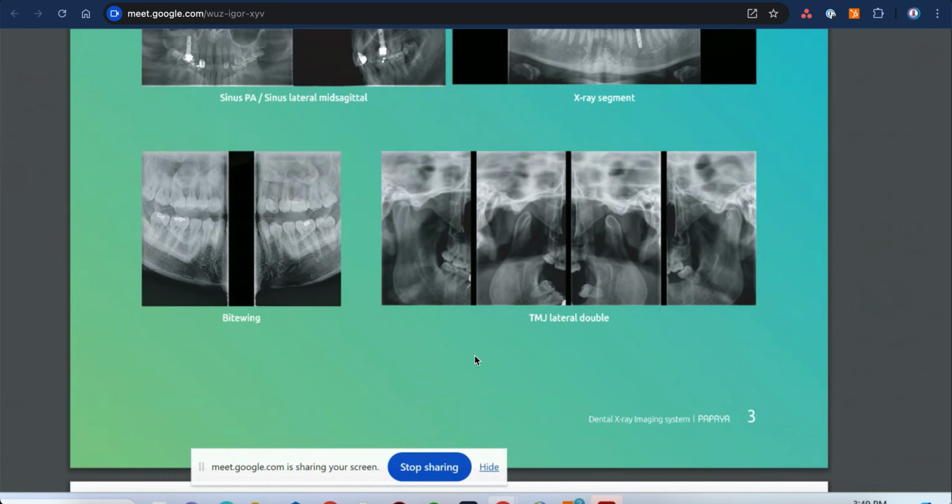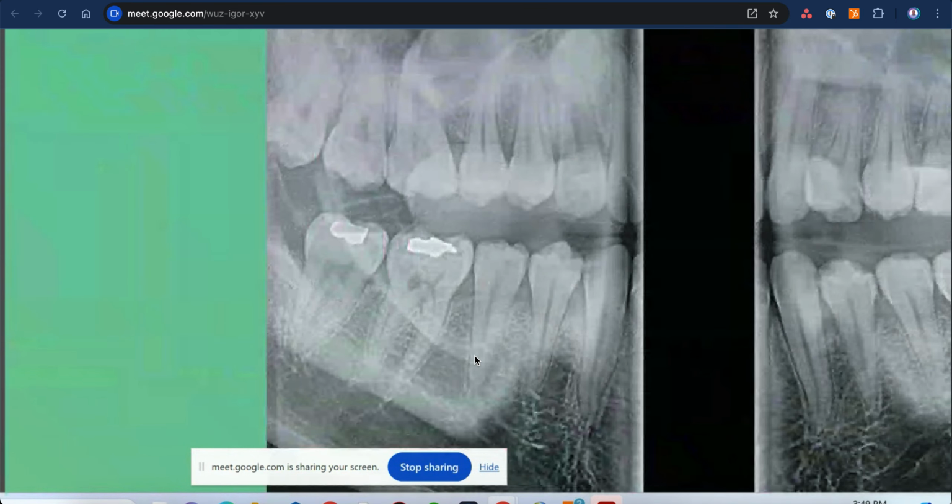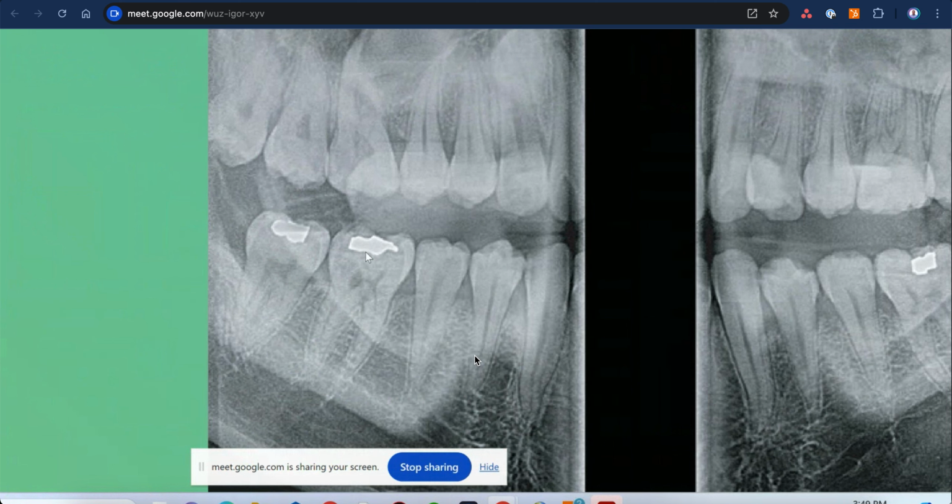Okay, this is a bite wing. I want to see this composite. Okay, this is an amalgam restoration. And I want to check this, for example, when the patient came to the clinic explaining some discomfort on this side. So instead of doing the periapical, which only has this one, I can use the bite wing. This is called a bite wing. I can get the teeth on this side and the teeth above them. Not just the lower teeth, not just the upper teeth, but both jaws can appear here. Is it clear?